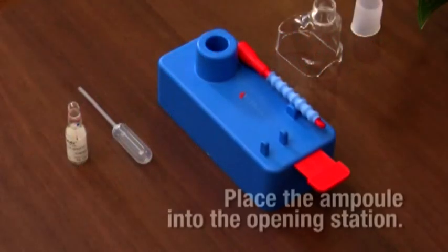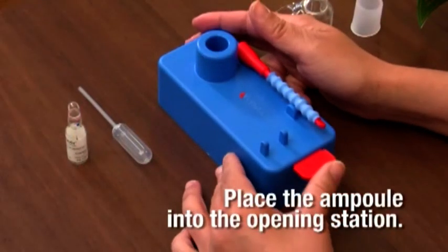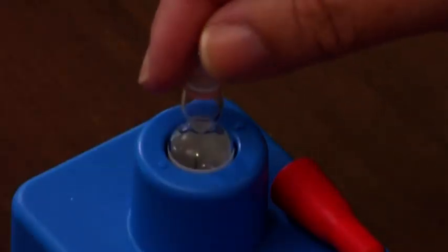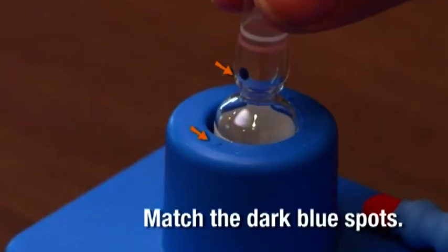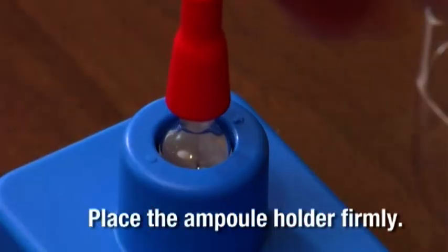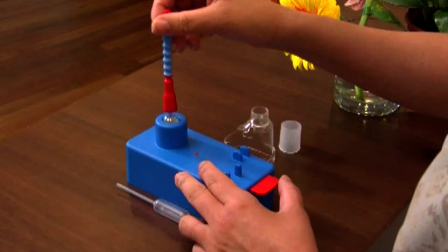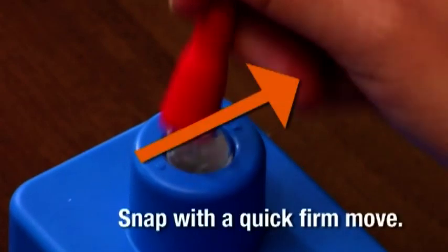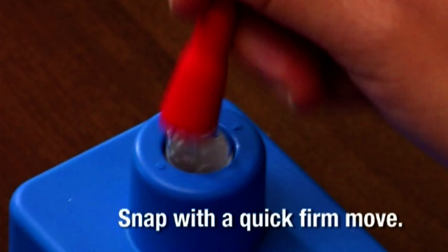Place the ampoule into the opening station, ensuring that the dark blue spot on the ampoule matches that on the opening station. Place the ampoule holder firmly onto the ampoule. Hold the base of the opening station so that it will not move. Break the ampoule by snapping the neck with a quick, firm move of the holder in the direction indicated.